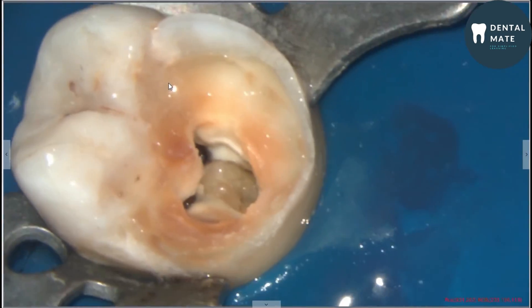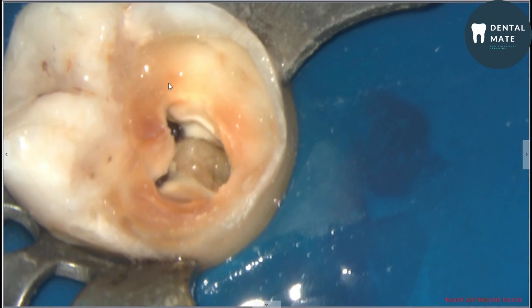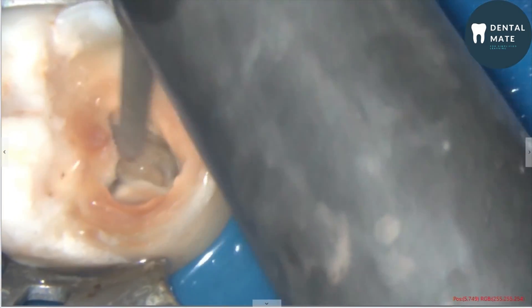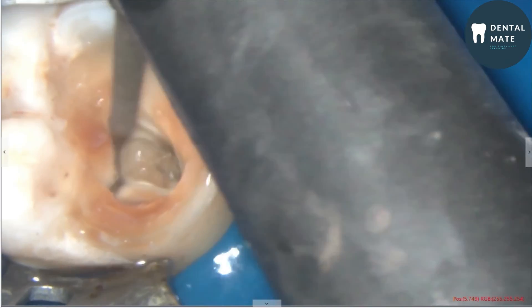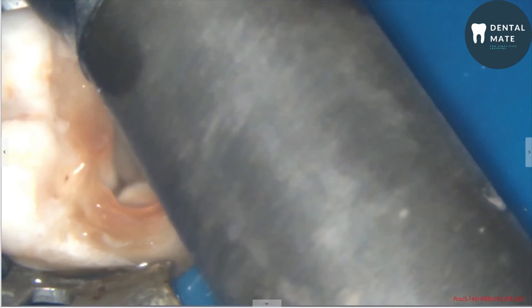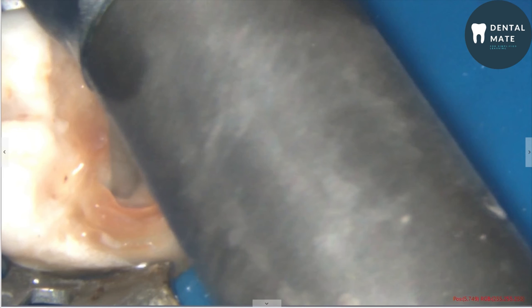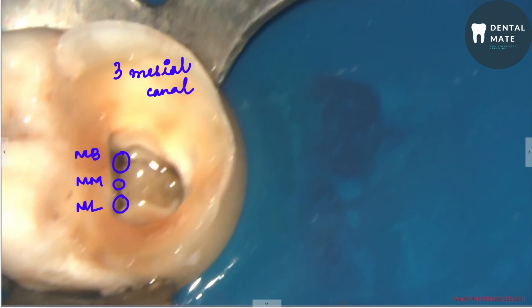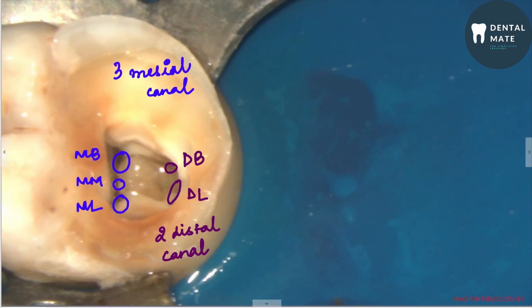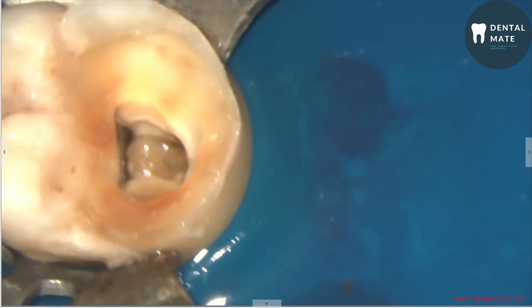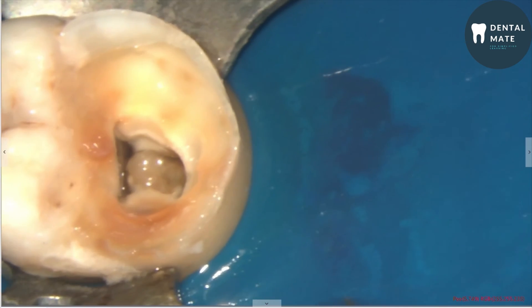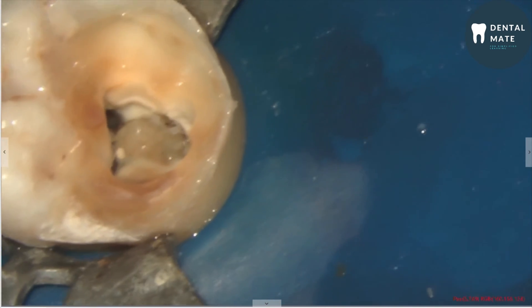After completely de-roofing the pulp chamber, we have to gain a straight-line access to all the orifices and to the canals. Now we can appreciate three mesial and two distal canal orifices: mesiobuccal, mid-mesial, mesiolingual, distobuccal, and distolingual orifices.